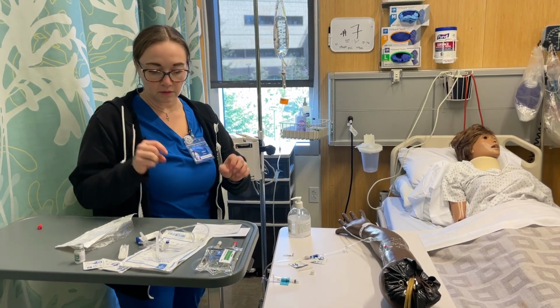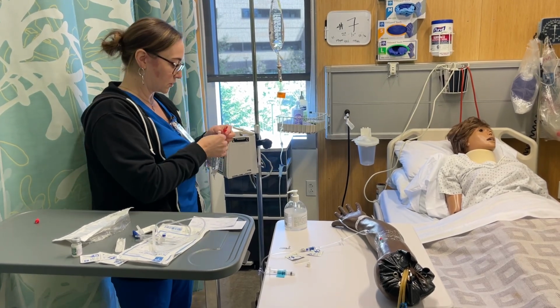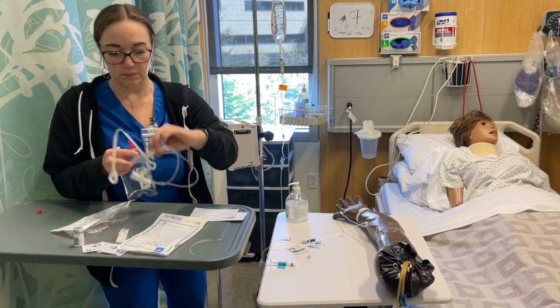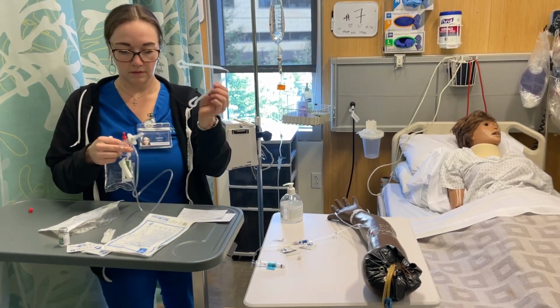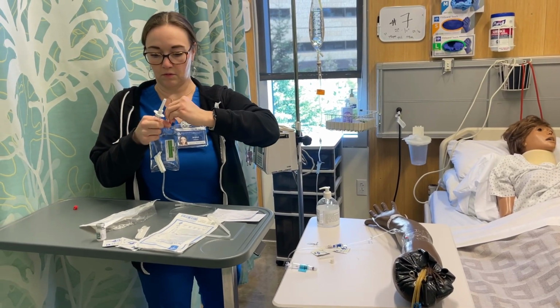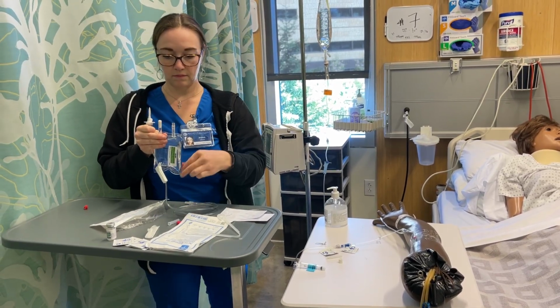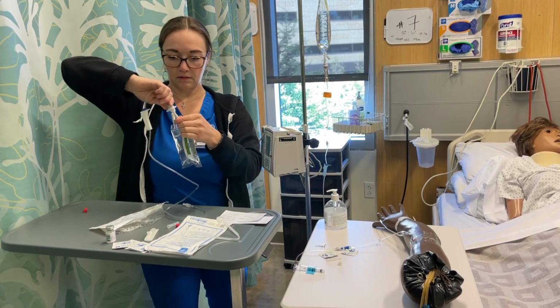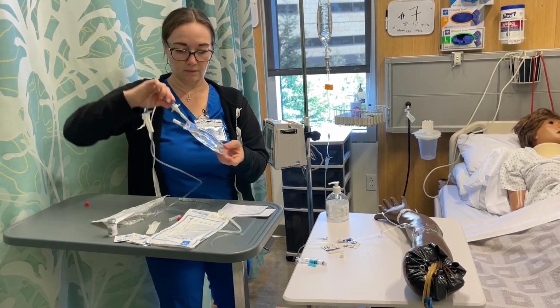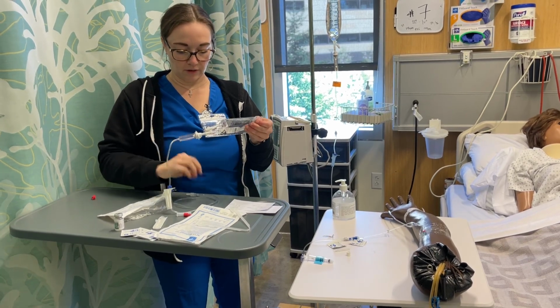Now I'm going to prime the secondary line, and this is for antibiotics. And so I'm going to grab that. I'm going to spike the bag. This is for the piggyback. Spike the bag here. Pull that off. And spike the bag. And I'm also making sure that it is the right prescription, right strength, expiration's good, right patient, right route.